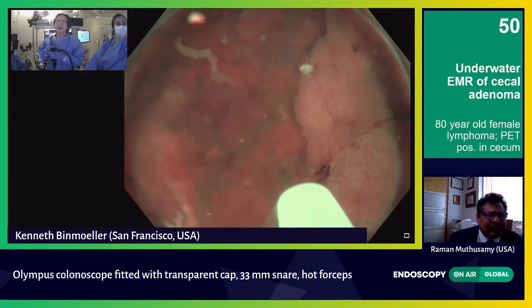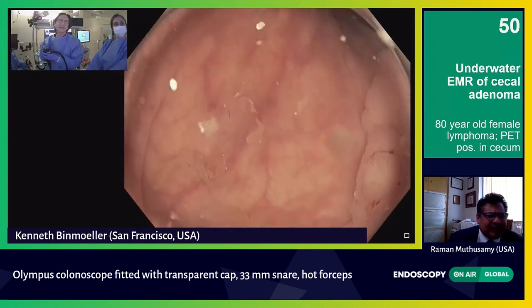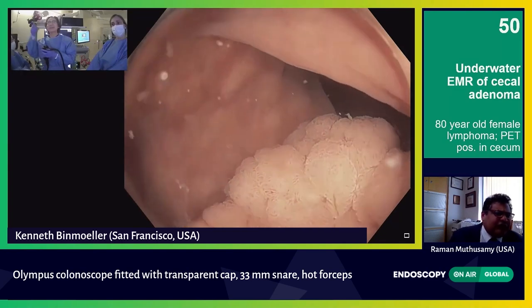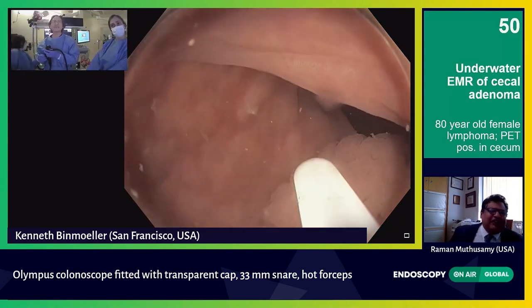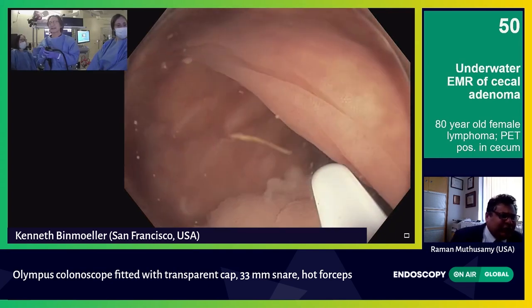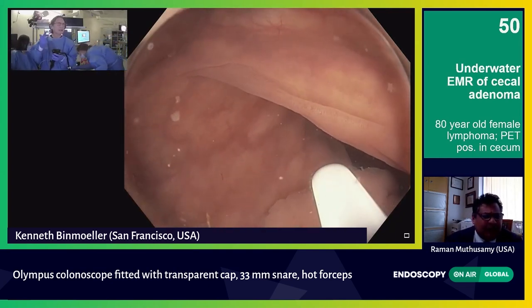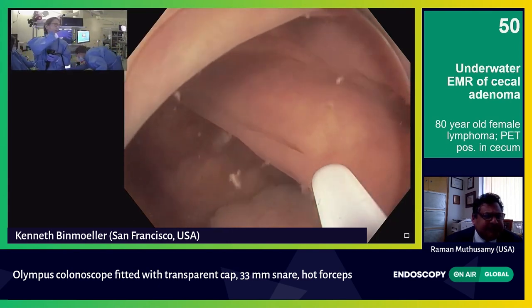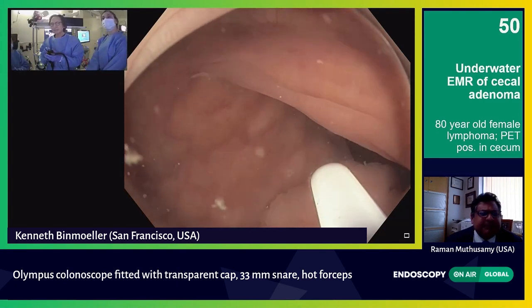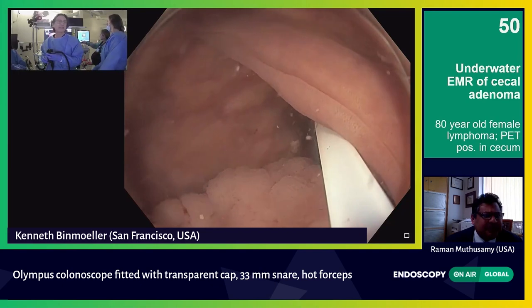In the interest of time, I'm not going to make dots around the entire perimeter. For our audience — what are your electrosurgical unit settings when you're making those? So I'm using pure cutting current, auto-cut. I'm using auto-cut and effect 5, and wattage is 80.